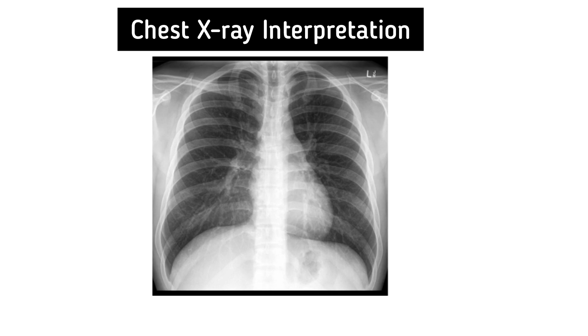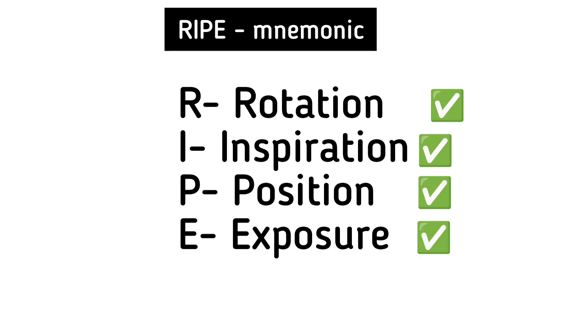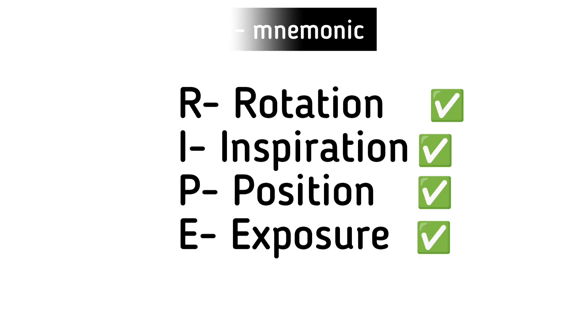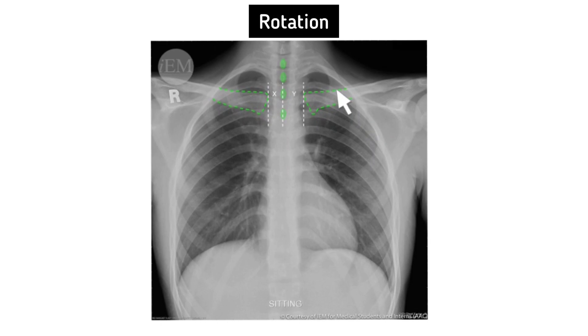We will give some pathologic examples. While assessing the image quality, the RIPE mnemonic is used, where R stands for rotation, I stands for inspiration, P stands for position, and E stands for exposure. First, let's talk about rotation.